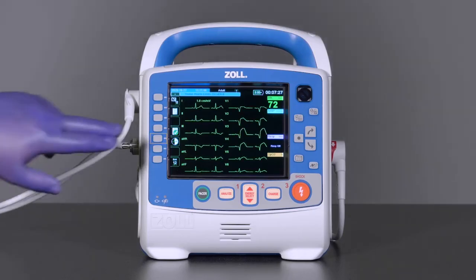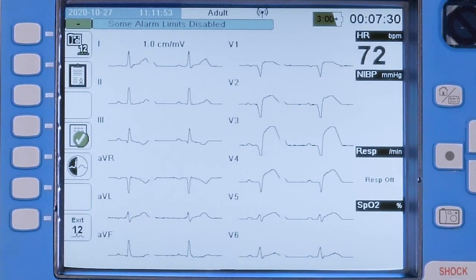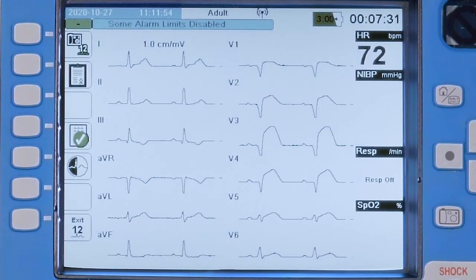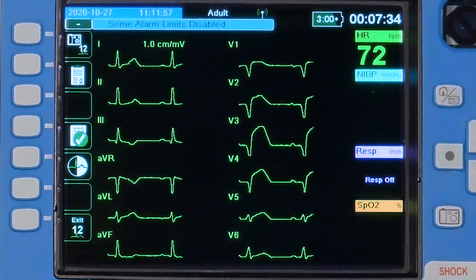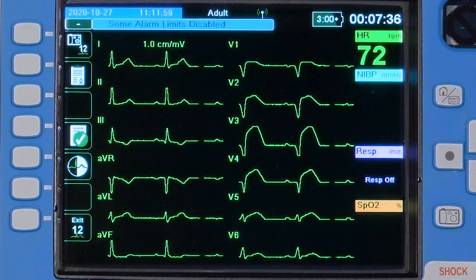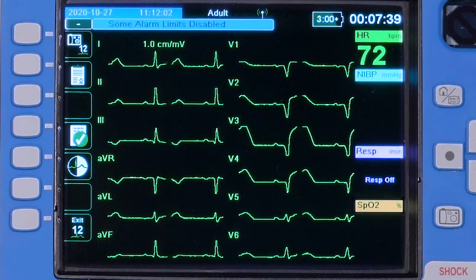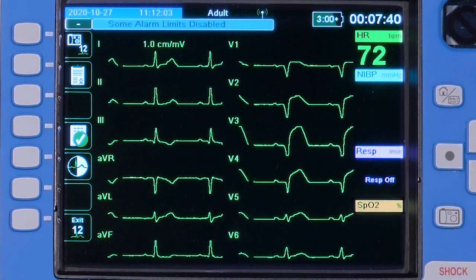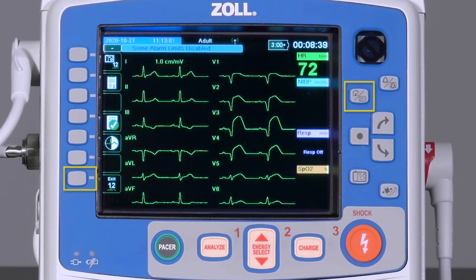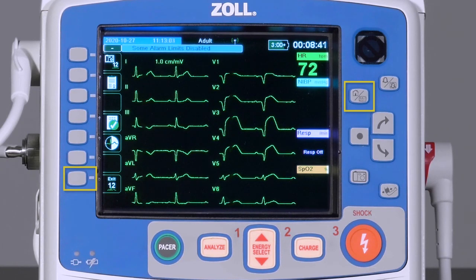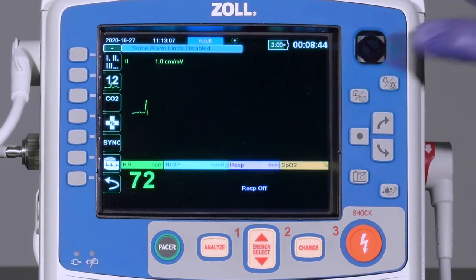Press the contrast button to change the display to a high contrast black and white view. Press again to return to the color display. If configured, a screen that can be viewed using night vision goggles is also available. Exit the 12-lead ECG functions by either pressing Exit 12-lead or Home buttons.